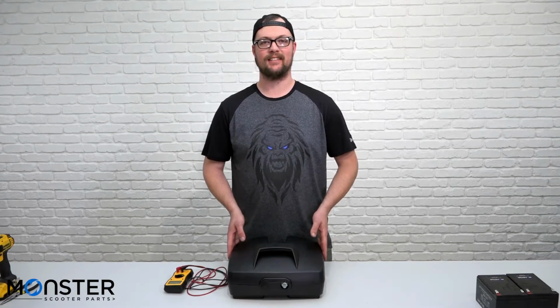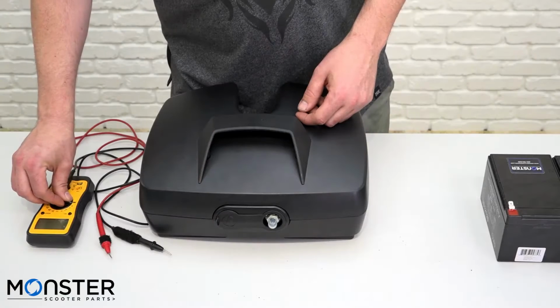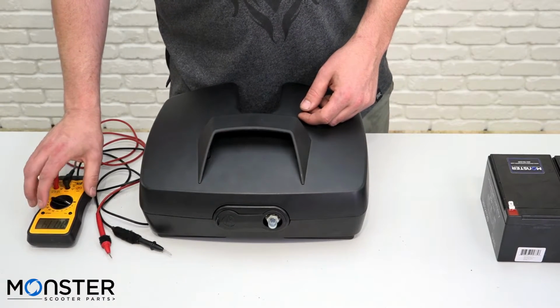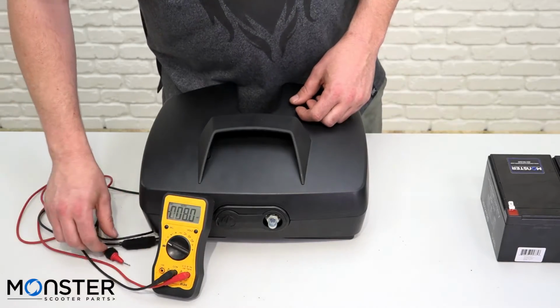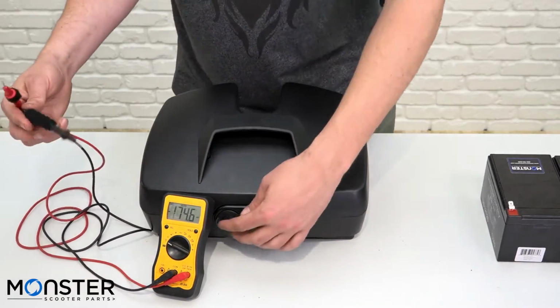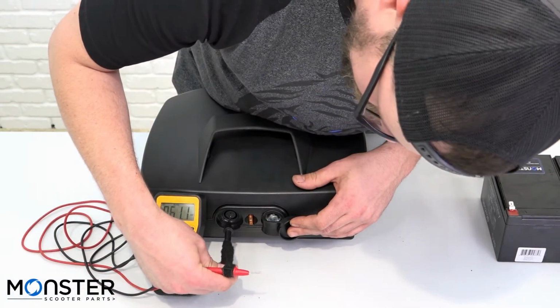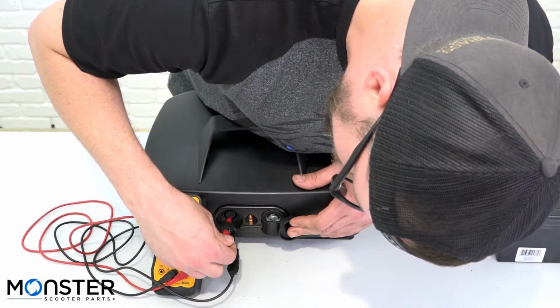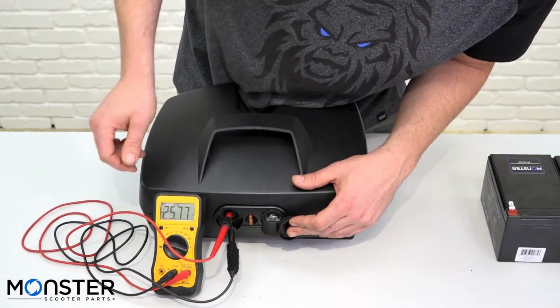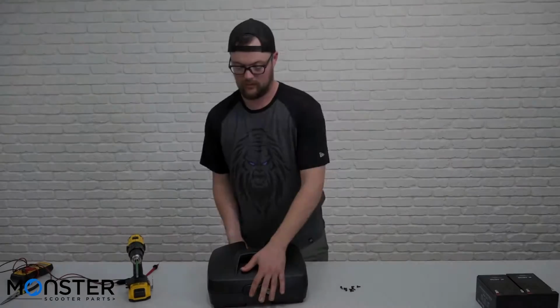And before we take our last steps here, we're going to be making sure we've wired everything up correctly. We're using our handy dandy multimeter, working in direct current or DC. We'll be working with the charging port here. The black prong will go in the bottom port and our red prong will go in our top port. We're going to be looking for at least 24 volts. Just like that, we know we're hooked up.